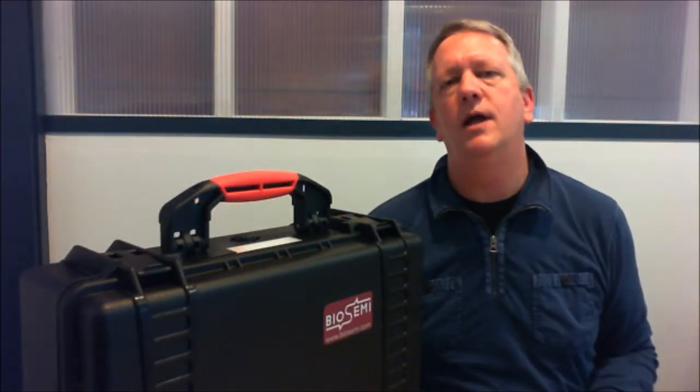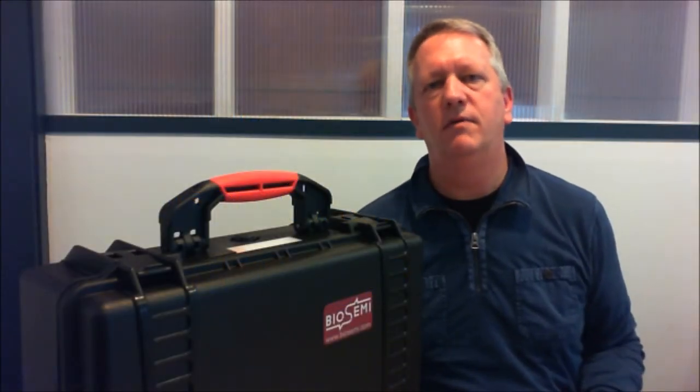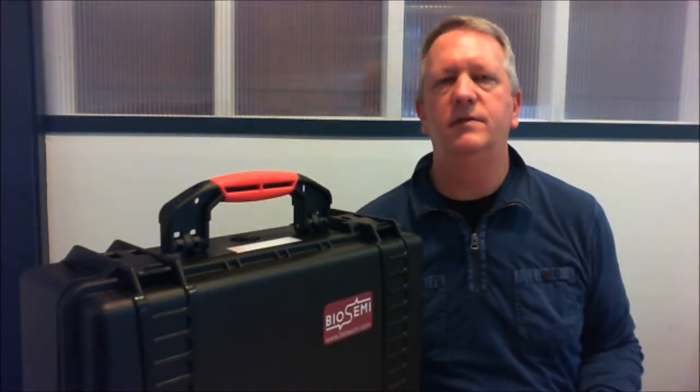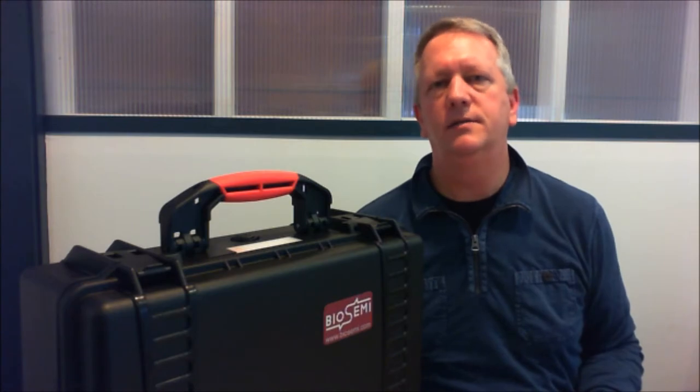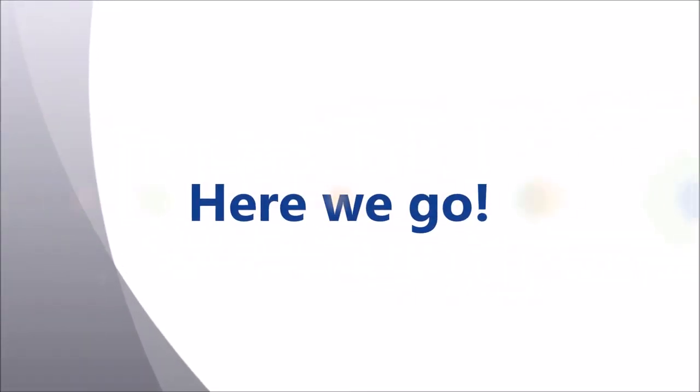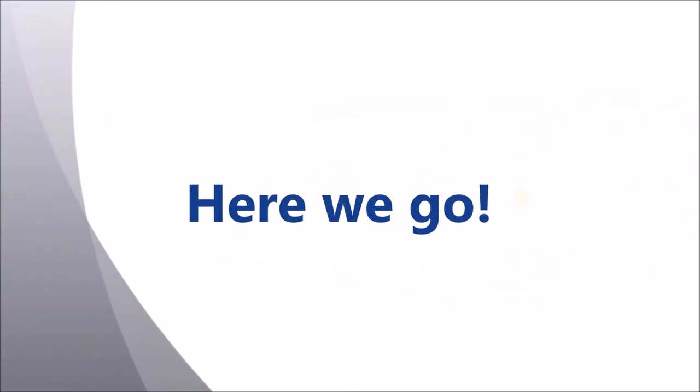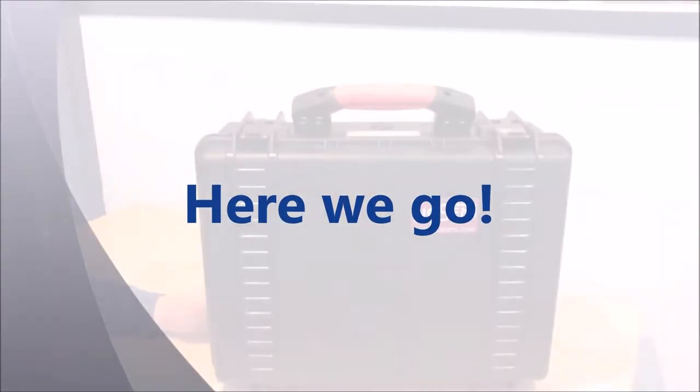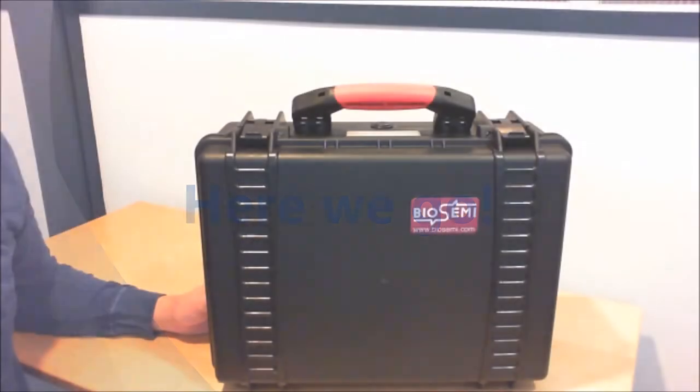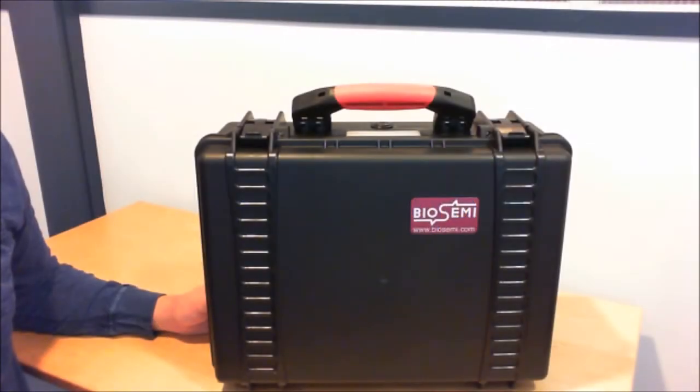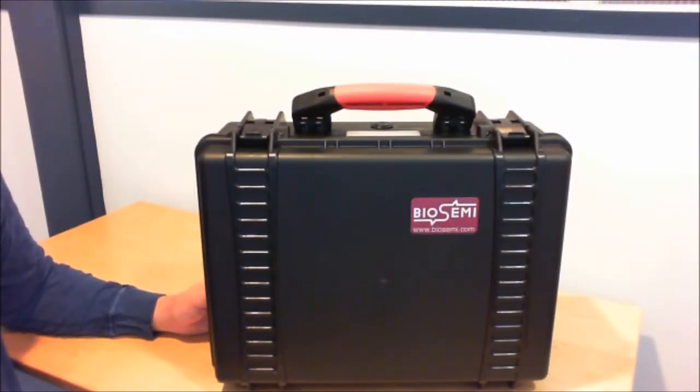Today's video will show the unboxing of a Biosemi-Active II EEG system. This is the rugged carrying case in which the Biosemi-Active II system is delivered.